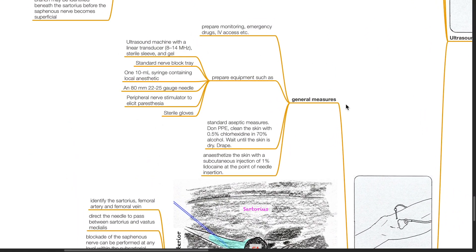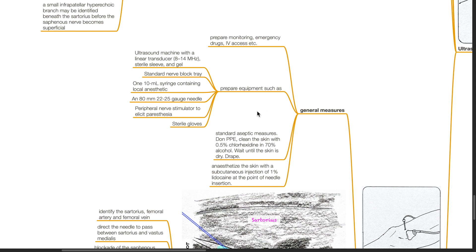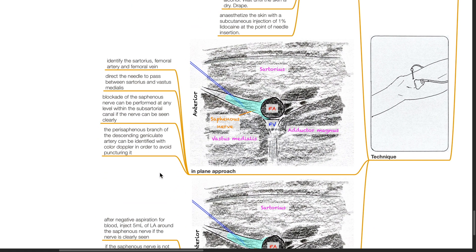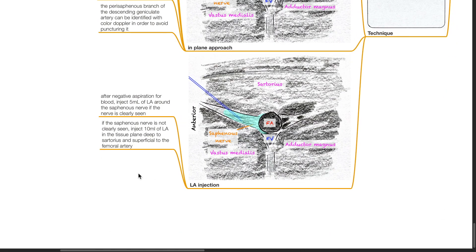Ultrasound technique — general measures: prepare monitoring, emergency drugs, IV access, and equipment; use standard aseptic measures and anesthetize the skin with 1% lidocaine at the needle insertion point. In-plane approach: identify the sartorius, femoral artery, and femoral vein, then direct the needle to pass between the sartorius and vastus medialis. Blockade can be performed at any level within the subsartorial canal if the nerve is clearly seen. The perisaphenous branch of the descending geniculate artery can be identified with color Doppler to avoid puncturing it. After negative aspiration, inject 5 mL of LA around the saphenous nerve if clearly seen, or 10 mL of LA in the tissue plane deep to the sartorius and superficial to the femoral artery if the nerve is not visible.